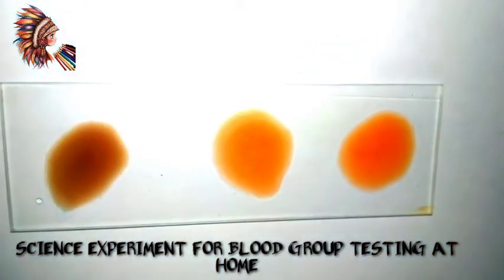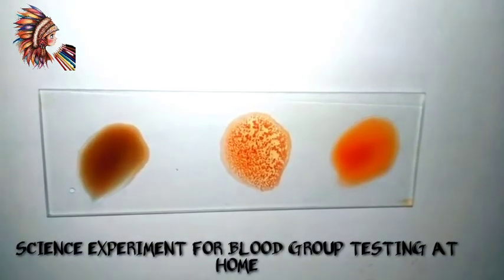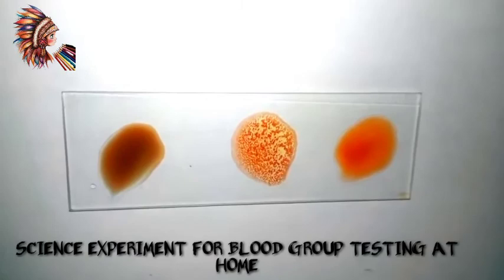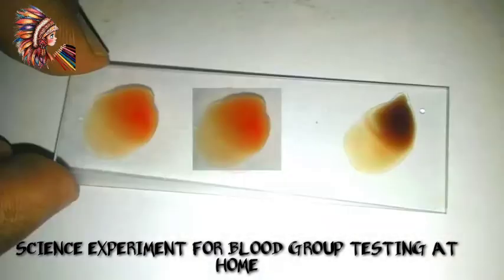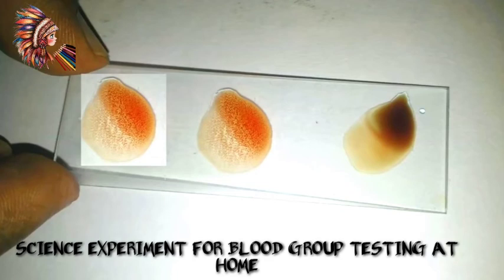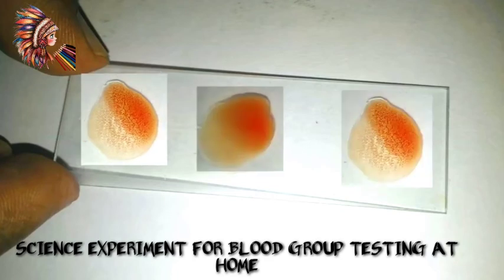As you can see in the center, this is how B negative looks like. Similarly, B positive looks like this. O positive is like this, then O negative, AB positive, AB negative, A negative, and A positive. Thank you!